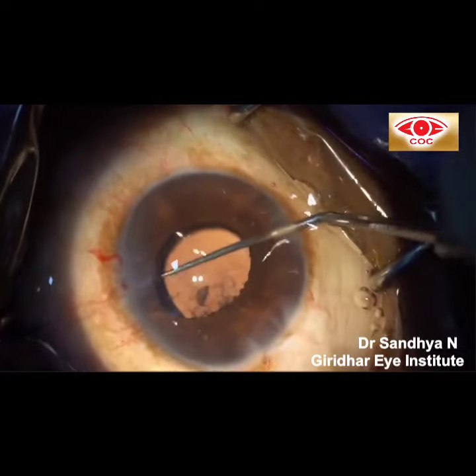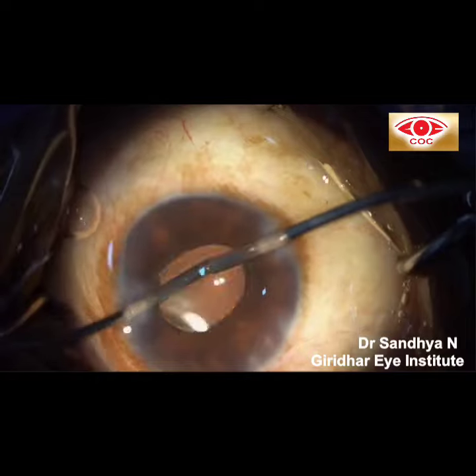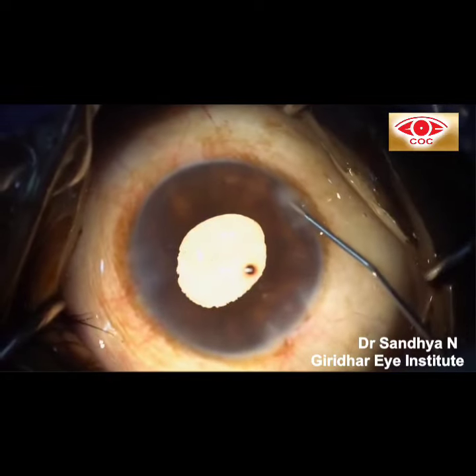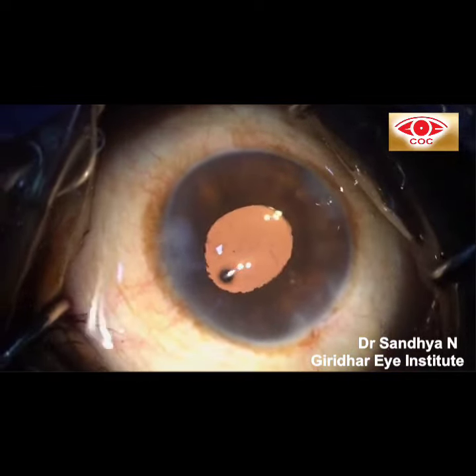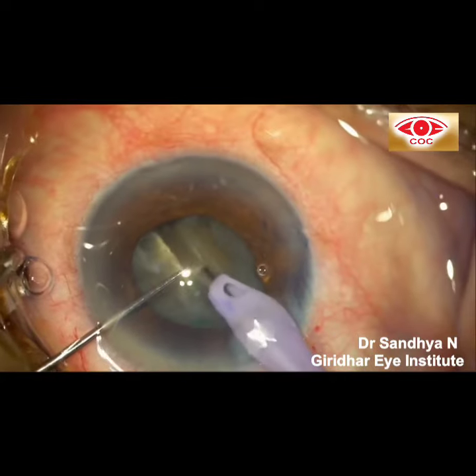During all these maneuvers, the endothelium was protected using dispersive OVD. Pilocarpine can be injected intracamerally to constrict the pupil. The side ports were hydrated gently without causing any further iris prolapse.